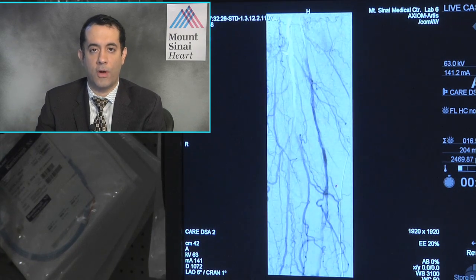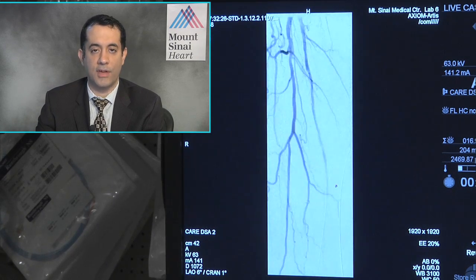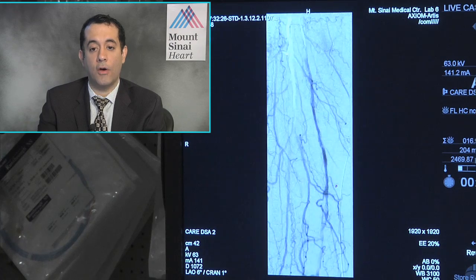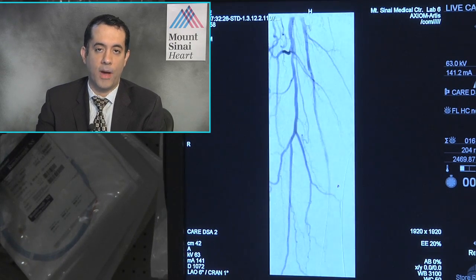Of course, you can argue one way or the other, doing Supera stenting, how comfortable you are, and the calcification, but it's merely based on how the lesion behaves, especially. I mean, my go-to is atherectomy followed by the decision making.